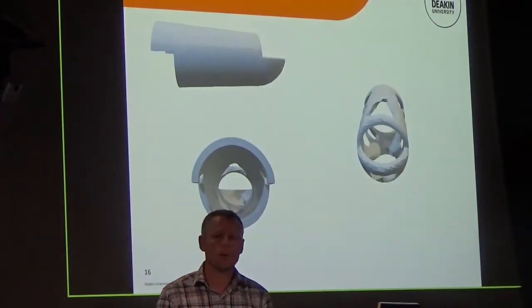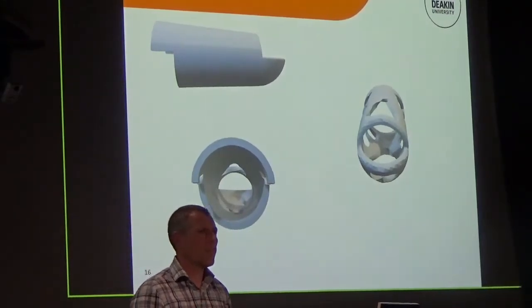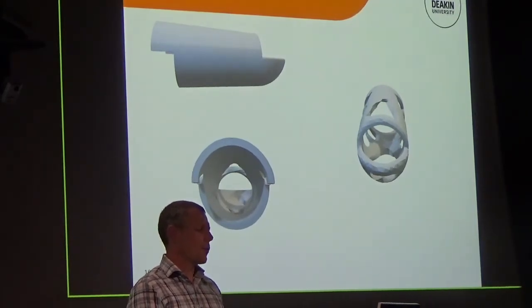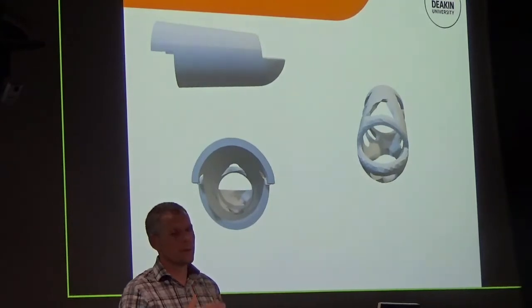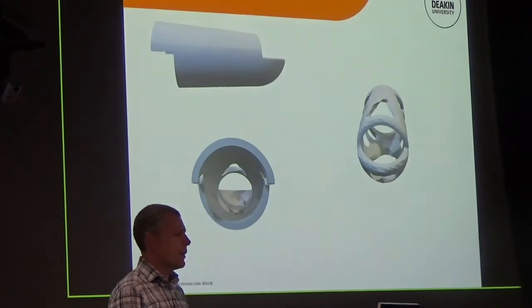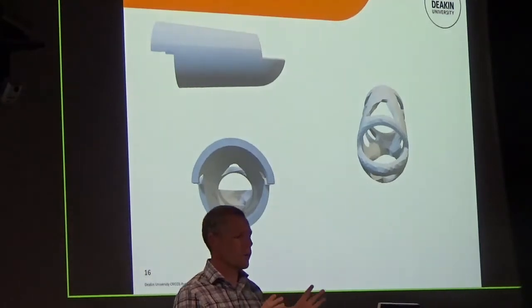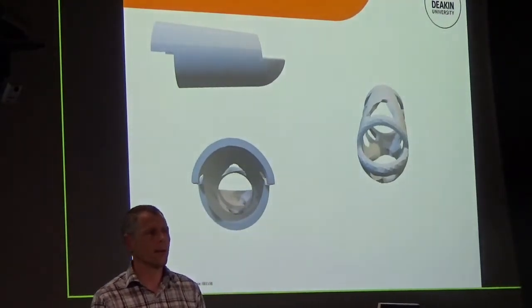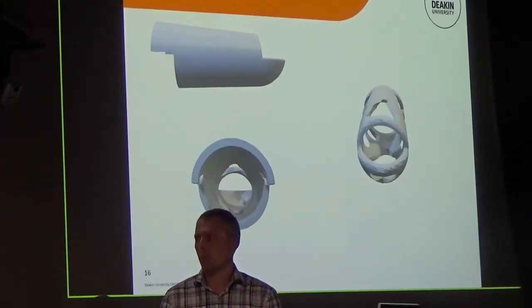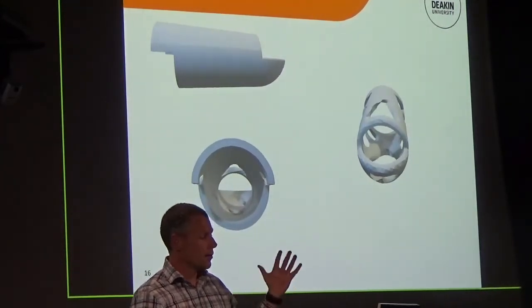So in terms of this, what you can start thinking through this process is airflow, access to the skin for touch and precision, sensation, and also moisture content, but it keeps the same result. So there is no strength loss for that splint. So again, that might open your mind to start thinking, okay, there's some splints that are pretty chunky and bold, and people take them off all the time anyway because they're sweaty and they get wet. How can we modify that to make them far more applicable to the situation and increase our compliance and adherence to wearing splints?